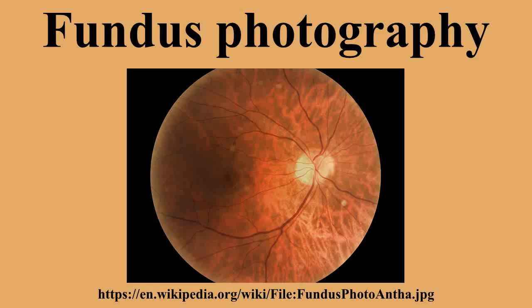History. The concept of fundus photography was first introduced in the mid-1800s, after the introduction of photography in 1839. The goal of photographing the human ocular fundus was slowly but surely becoming more achievable. In 1851, Hermann von Helmholtz introduced the ophthalmoscope, and James Clerk Maxwell presented a color photography method in 1861. In the early 1860s, Henry Noyes and Abner Mulholland Roseborough both assembled fundus cameras and tried fundus photography on animals.